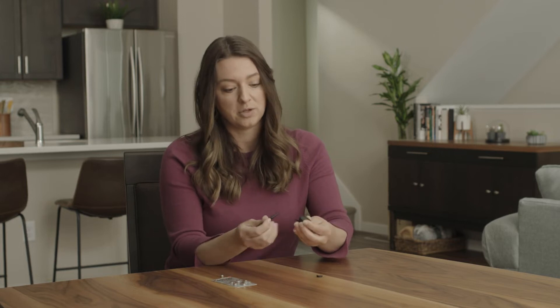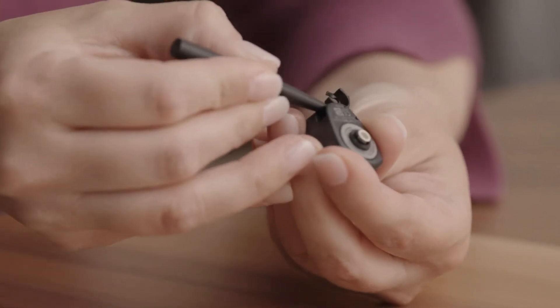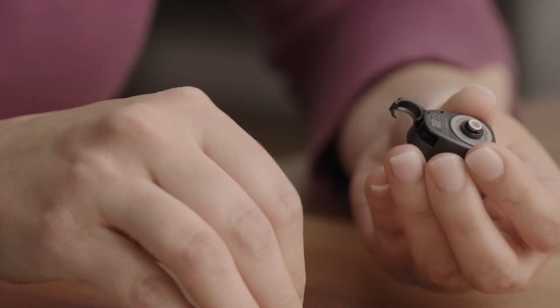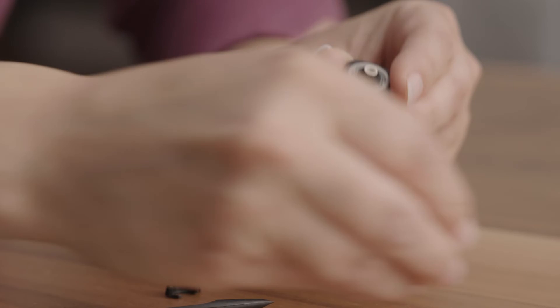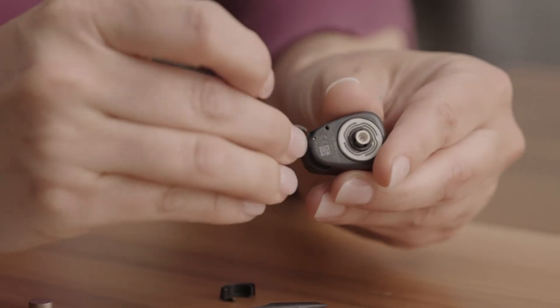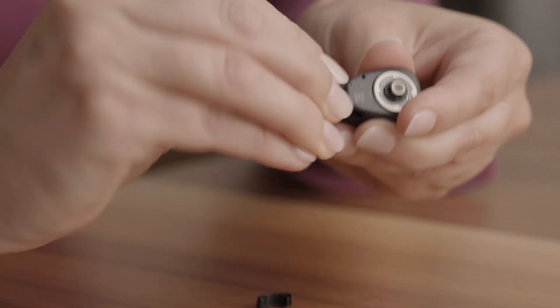To swap the standard door for a tamper-proof door, use the battery door tool to pull the door out. The tamper-proof door snaps into place like this.